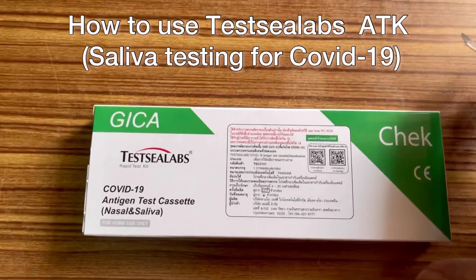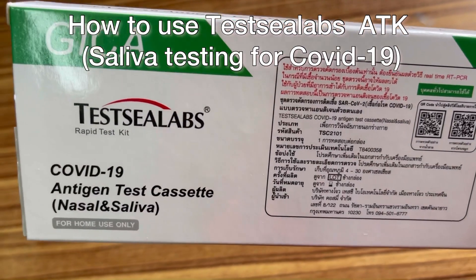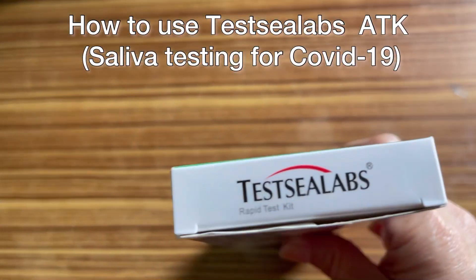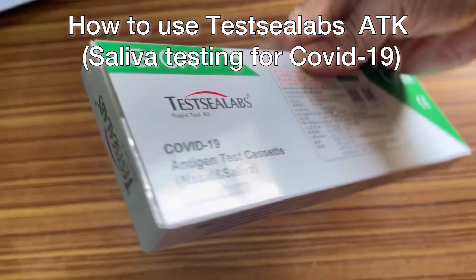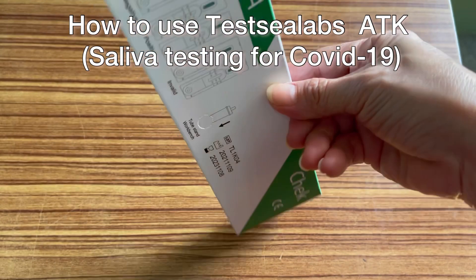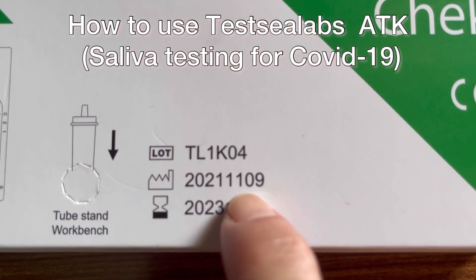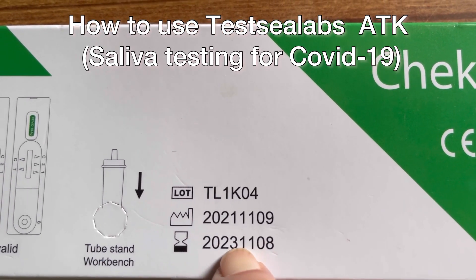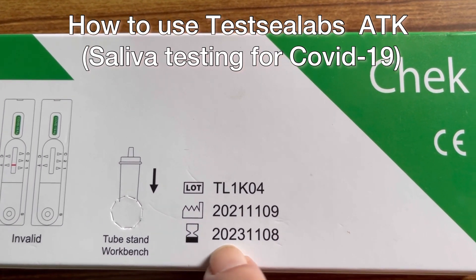Hello guys, today I'm going to review the Jika Test C Labs COVID-19 antigen test cassette for nasal and saliva. As you can see, this is a rapid test kit. The brand name here is Test C Labs. At the back, you can see the manufacturing date: November 9, 2021, and the expiration date: November 8, 2023.